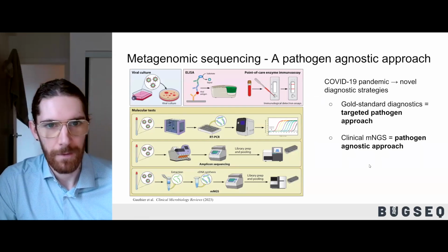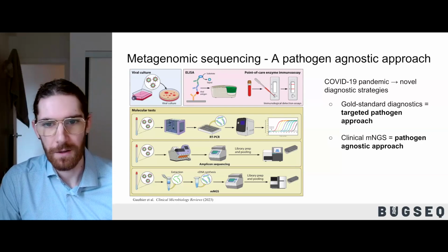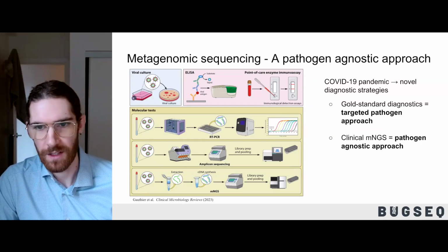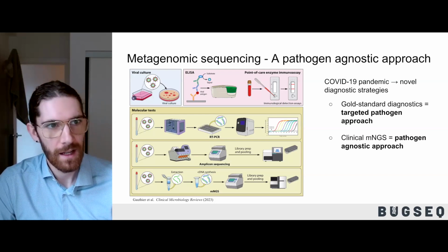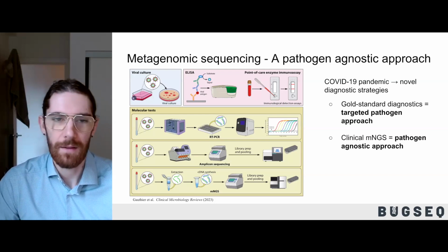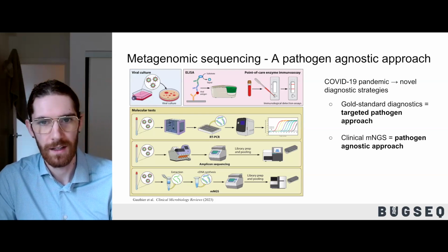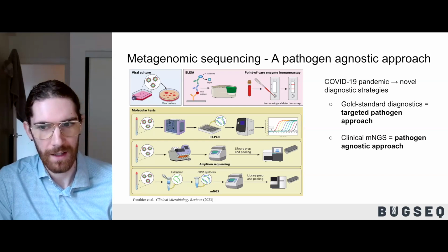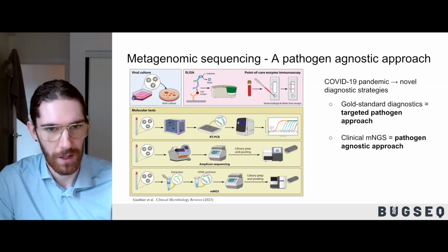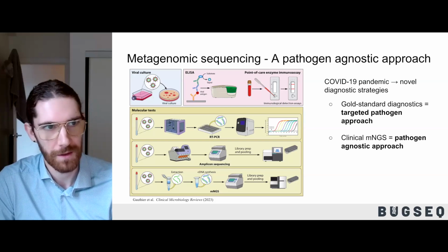I'll spend the first part of my talk today talking about some work we've been doing to develop, automate, and translate end-to-end respiratory metagenomics assays in clinical settings. And then I'll spend the last half of the talk talking about some work that BugSeq's been doing on the bioinformatics side to develop robust, accurate bioinformatic analyses for infectious disease and microbiology applications that are compatible with ONT sequencing workflows.